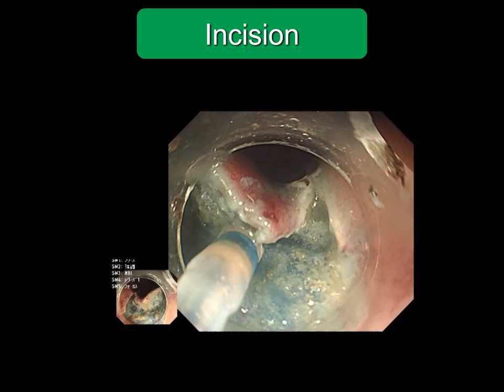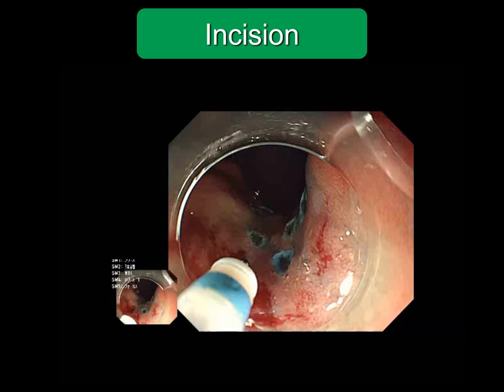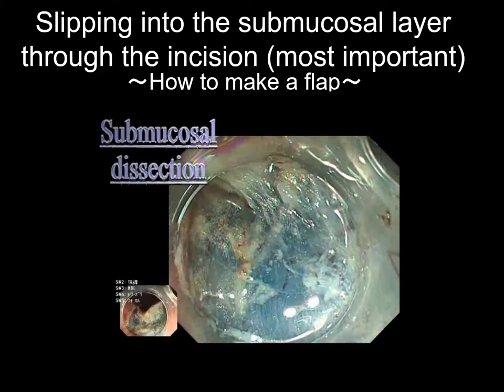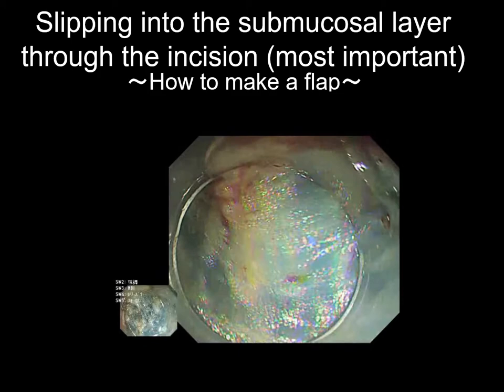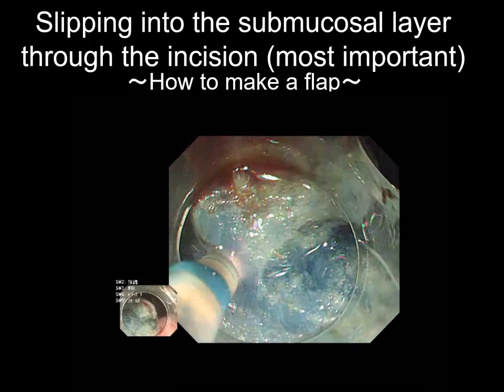This is a dangerous direction for beginners. Approach from the oral side or anal side is selected depending on the case. The operation in an inverted position more stabilizes endoscopy. Operation in an overlooking position is likely to be influenced by respiratory movement. The scope is slipped into the submucosal layer skillfully using the tip attachment. The most important point of ESD is the initial insertion of the scope into the submucosal layer.